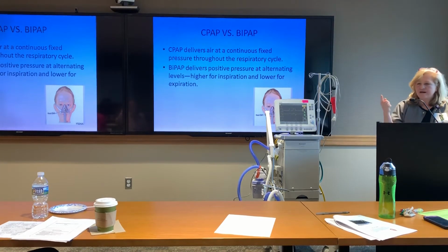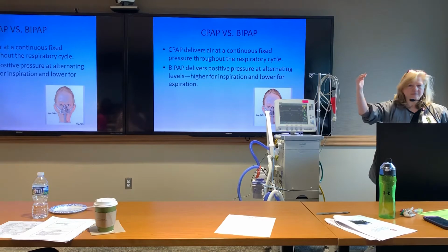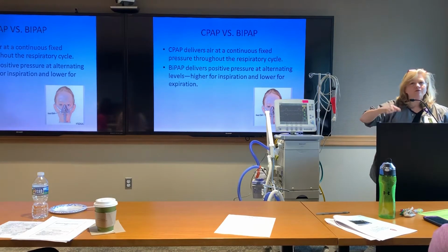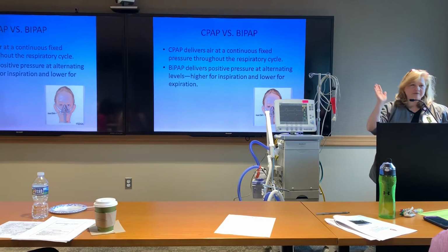Okay, if I set an IPAP of 10, if I do 5 over 10, I start at 5 and I go up to 10. If I set pressure support of 10, I start at 5 and I go 10 above the 5. So I'm going to go up to 15. So IPAP goes to the specific pressure dial. Pressure support is the change in pressure, the delta P. It's your delta P. All right.